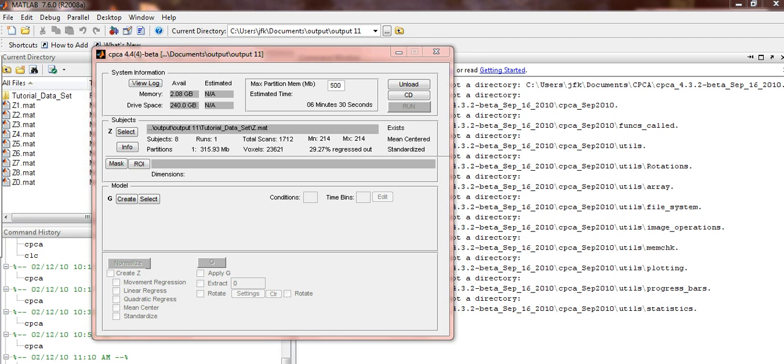Once the Creating Subject File window disappears, make sure that you have 8 .mat files, one for each subject, as well as a Z0.mat file.